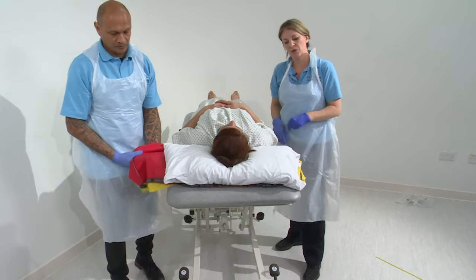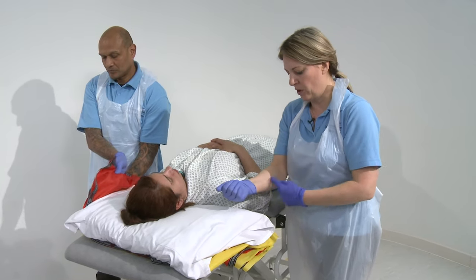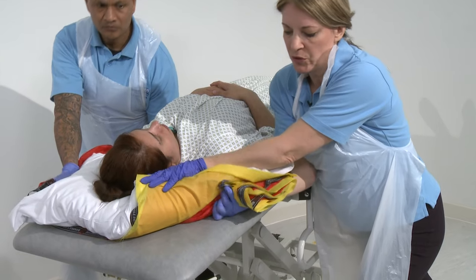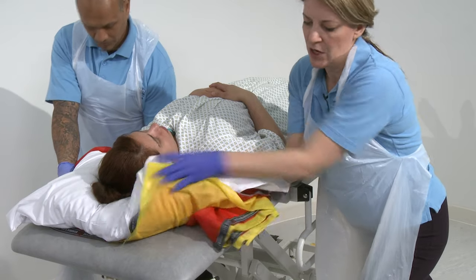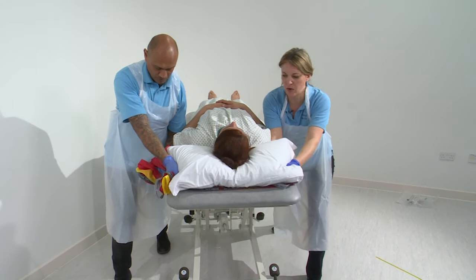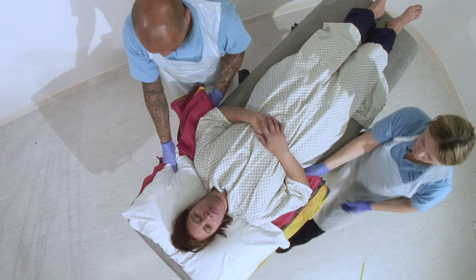Now we need to unfold it underneath Neha. So what I'm going to do is put my hand in underneath and fold my fingers over the top, leaving my forearm down the length of the bed. So it's hands in, slide through so that our hands are folded over the edge. What you don't want to be doing is scrunching this up because it ends up in a big knot underneath your patient. So nice flat hand straight in and fold your fingers over the edge. Outside hand, take hold of the pillow, hold it still, and now all we need to do is transfer our weight backwards. Ready, set, slide. And we pull it all the way through.